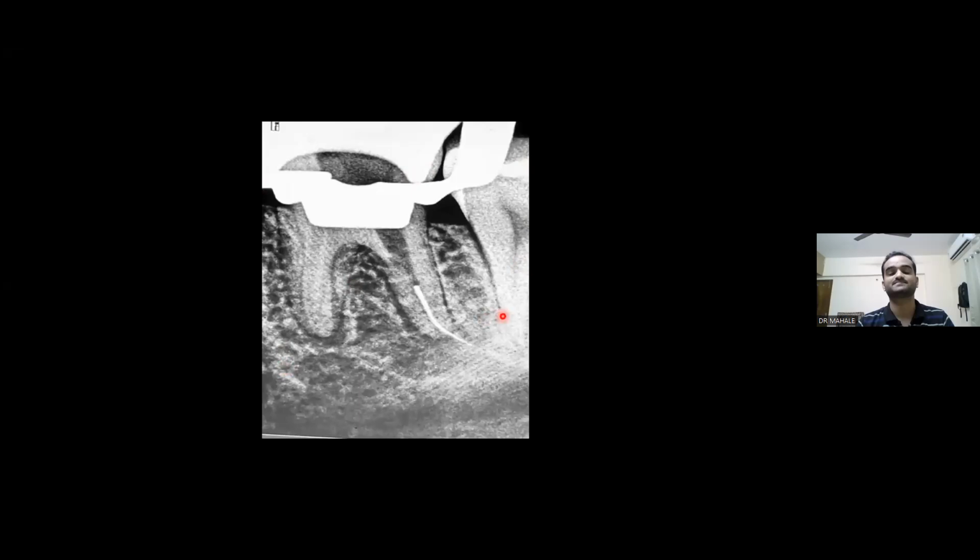all factors, I just stopped the appointment and put calcium hydroxide intracanal medicament. I gave TF and I sent the patient. I went home, took all the articles, all the books on file retrieval and read things. So when the patient came for the next sitting, I knew right from the starting what I'm doing. So this time the scenario is completely different.